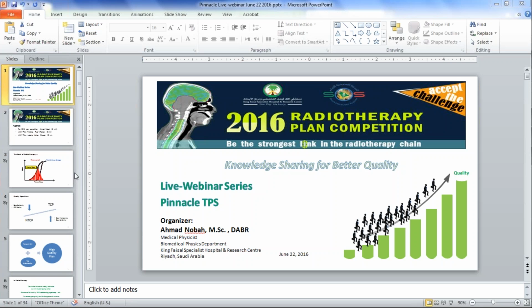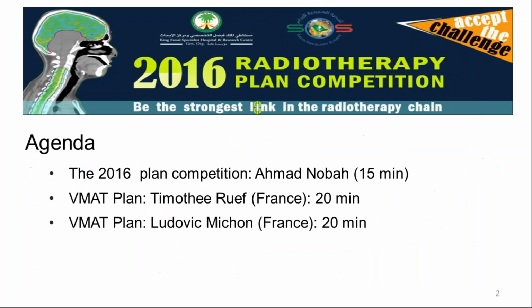And today's live webinar we will be discussing the top 2 plans in the Pinnacle treatment planning system. So this is the agenda of today's talk. I'll start with an introduction for about 15 minutes. Then Timothee and Ruef will present for about 20 minutes for his plan, followed by Ludovic, and then I will have some announcements to make.